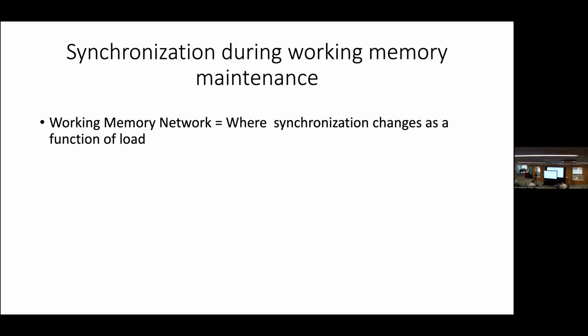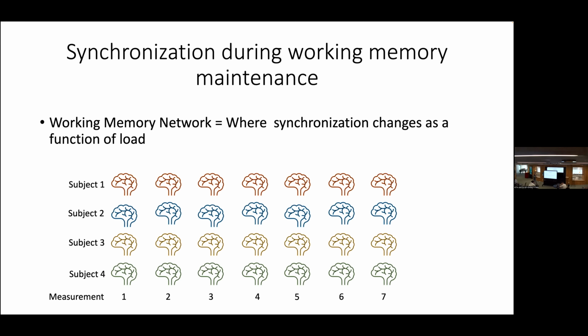Okay, so yeah, as I was saying, there's a lot of inter-individual variability here. So to deal with this, what we did was that instead of having a large group of people and then taking the average, we just had a few subjects and then we scanned them multiple times. And then we treated each subject as its own replication unit. So we did the whole analysis within single subjects. And then we looked at whether there are any similarities between these subjects.